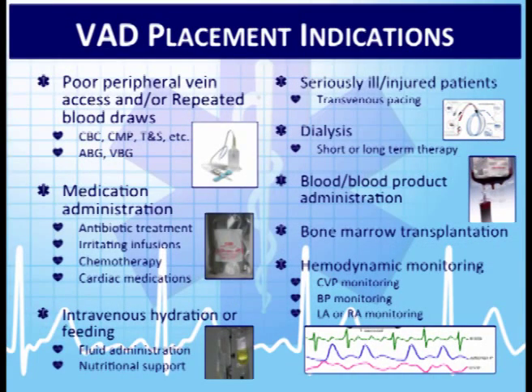Medication administration: if patients need antibiotics, that's not always done in the hospital environment anymore. Some people actually go home with IV antibiotics, and that's something in the field that paramedics and critical care paramedics may see, that a patient has to be on vancomycin for a month, and they're going to get that medication and administer it to themselves at home via their central line.